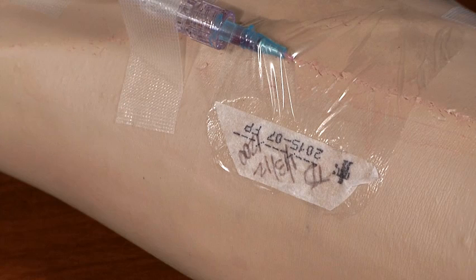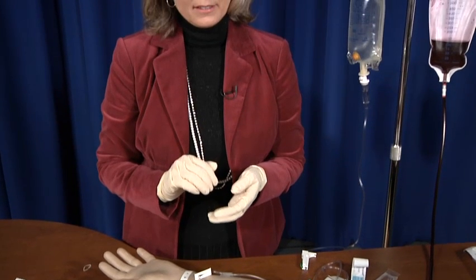I know when the site needs to be changed, because that's where you're going now, is to document in the chart. And you'll document that you started the IV, what you started, when you started it, how fast the rate is, how did the patient tolerate it, how many sticks did you have to do to initiate the IV. And that's it.